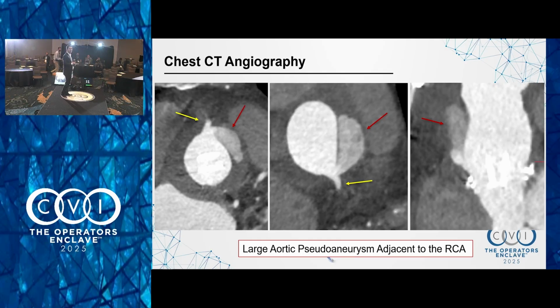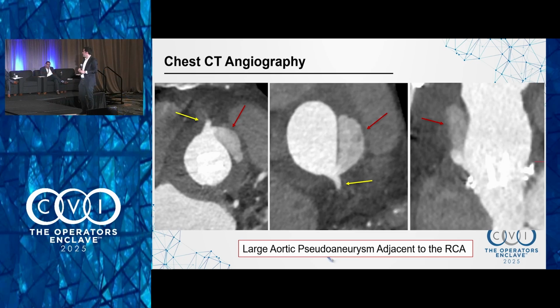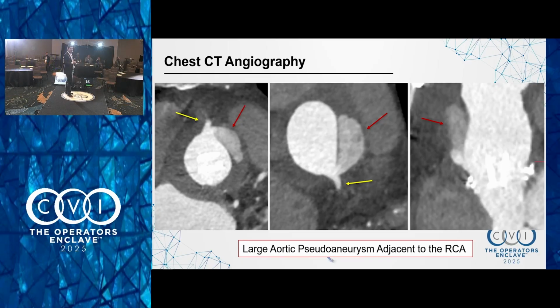To give you a little bit of an idea of what's happening, she has a large pseudoaneurysm that's originating, I think, right at the anastomosis, the RCA button. Her Bentall is working great. Her On-X is working. That thing is slowly but fastly growing right next to the RCA, and it was not there on a prior CT a year ago. So pretty new. One of our surgeons gave us a call and he's like, "You guys do something with it?"